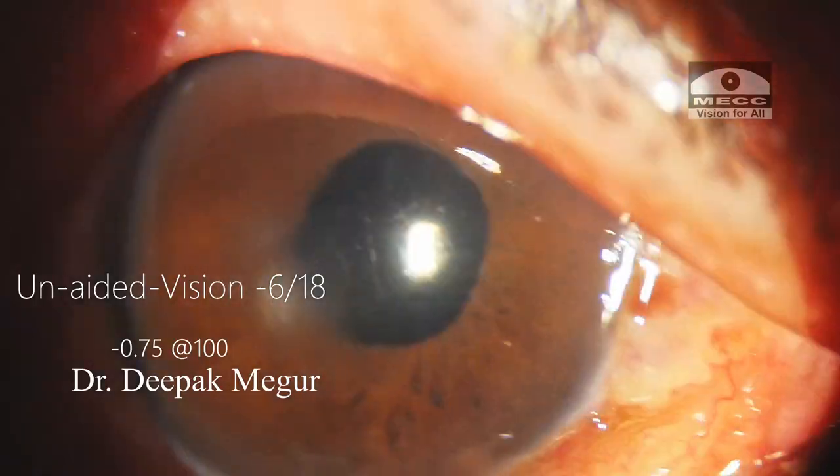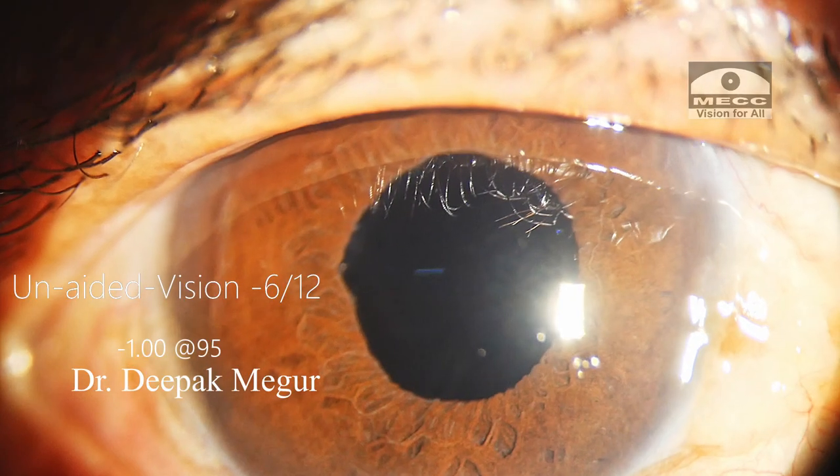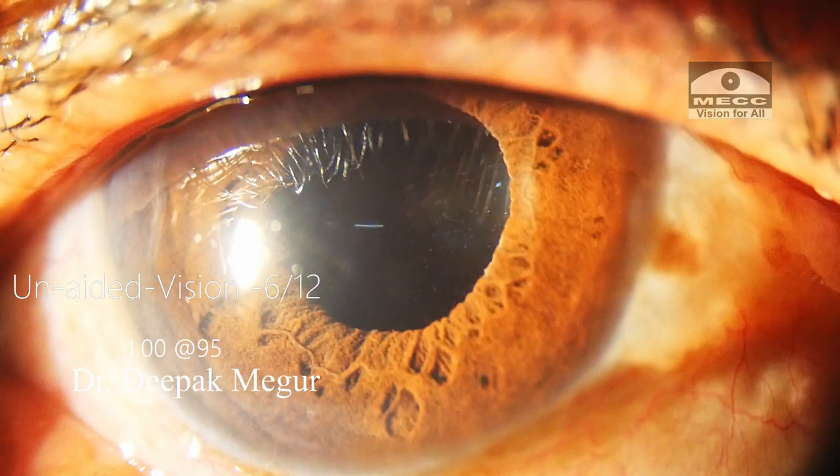This is the first post-op day, and this is how the eye looks on the fifth post-op day.